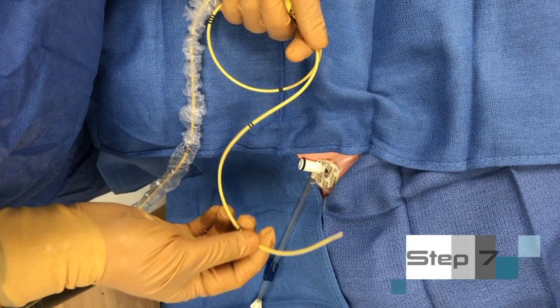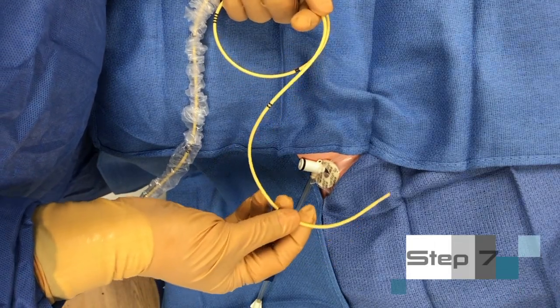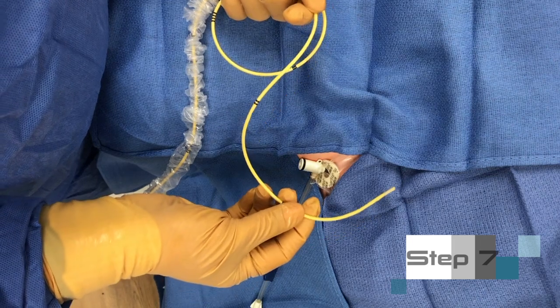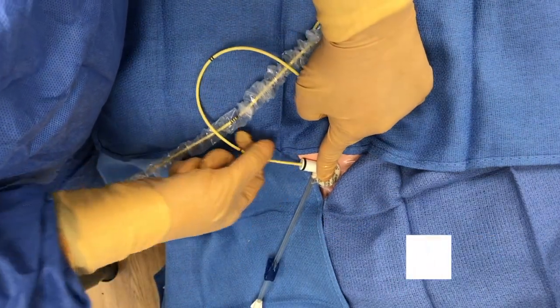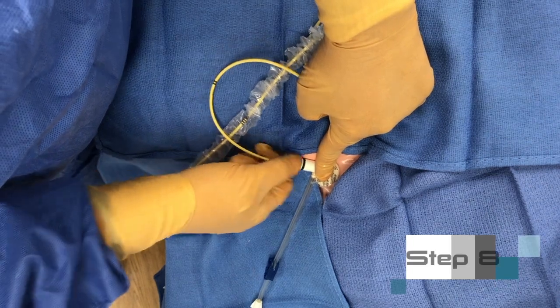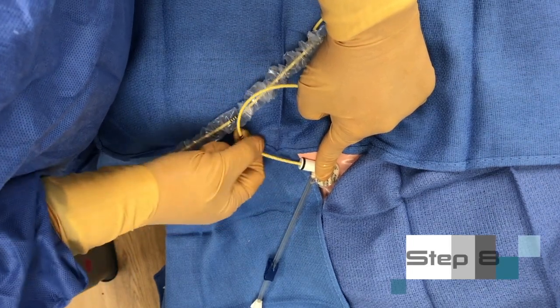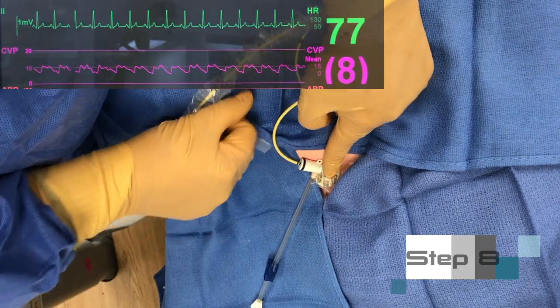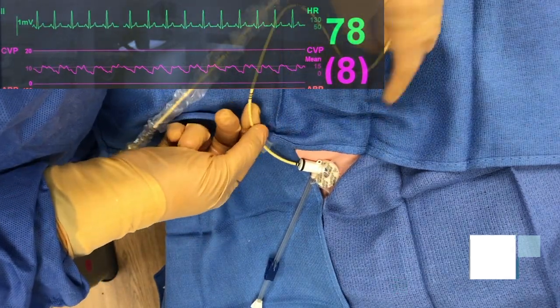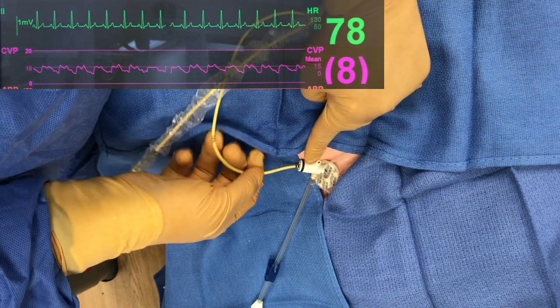Step 7. Insert the PA catheter into the introducer port of the central line with the natural curve of the catheter pointing towards the heart. Step 8. Advance the catheter to about 20 centimeters or until a CVP waveform is observed on the screen. This indicates that the tip of the catheter is in the superior vena cava or the right atria.